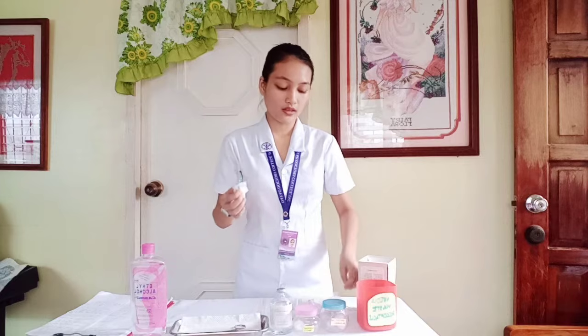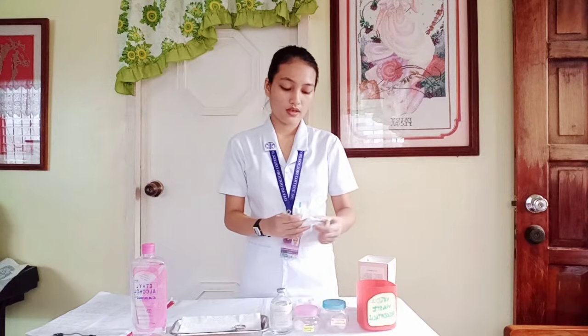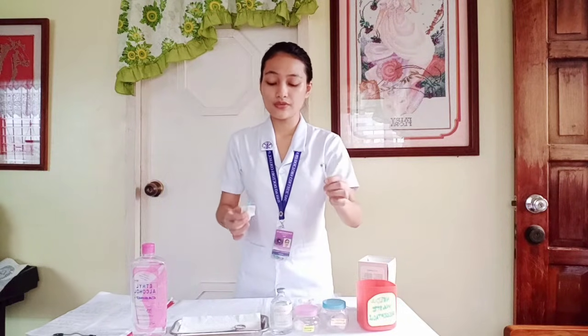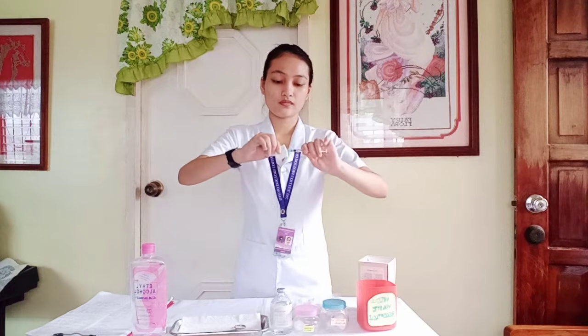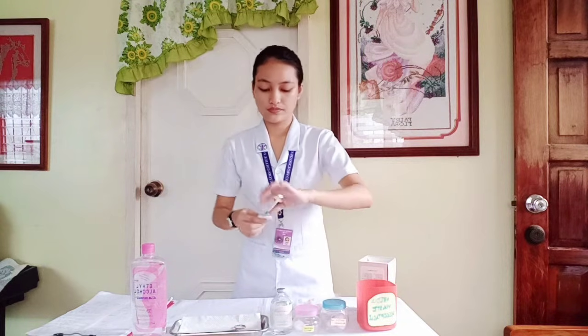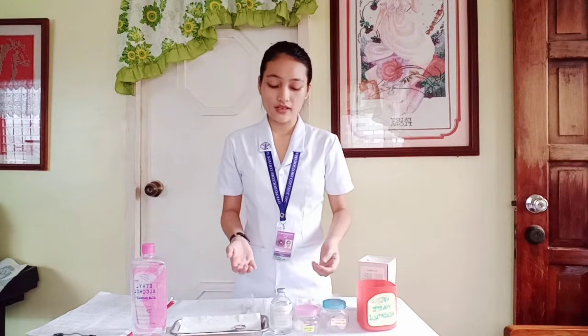Okay, so we'll also have to open the package of the vial access device or the aspirating needle, and then connect the barrel of the tuberculin syringe to the aspirating needle. Secure and ensure that the connection isn't loose. Okay, set it aside first, and then open the medication vial.